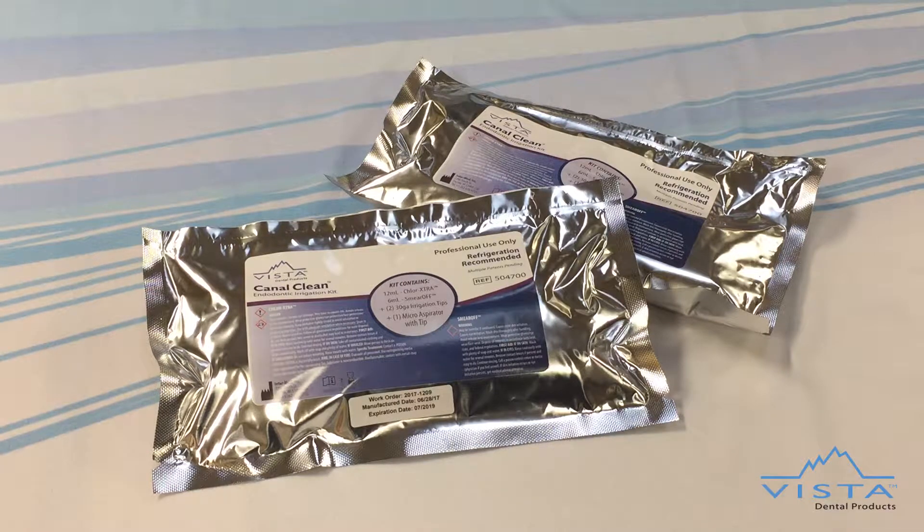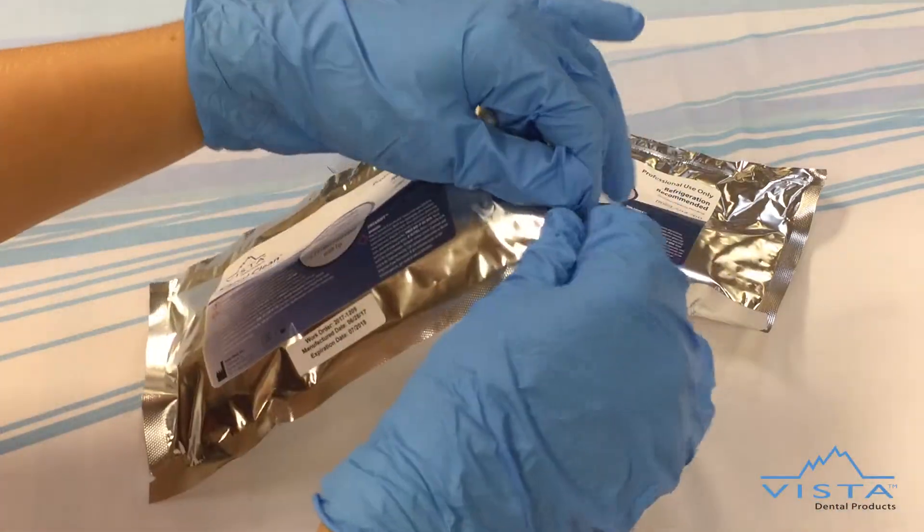Vista Dental Products introduces the newly redesigned Canal Clean, now in a simple, time-saving, two-step irrigation kit. Canal Clean comes in a convenient peel-and-use kit.